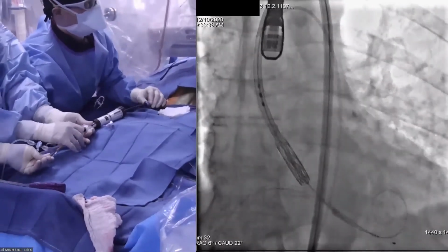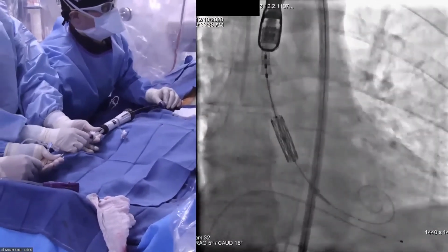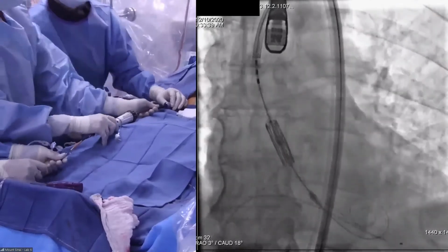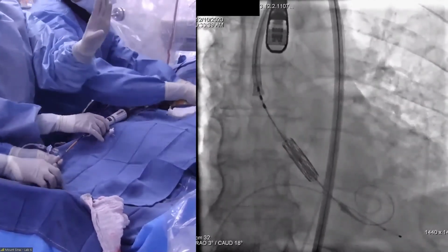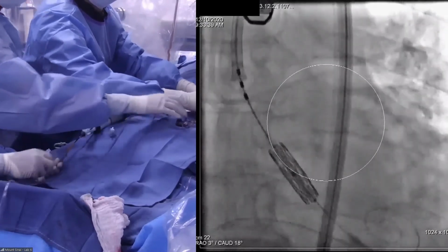Okay. Now we have to bring this catheter back. So back, the balloon is back. The valve is going to advance, good, adjust it. Okay, and again, please bring the pigtail back down, based on the calcium, you see that. I think it's 70 aortic, 30 LV.